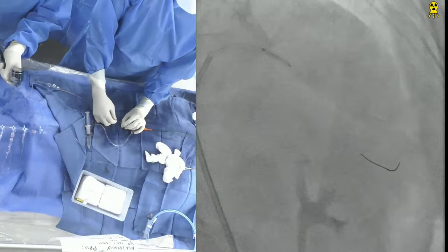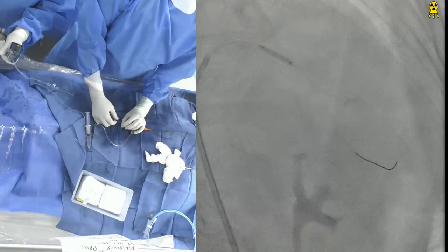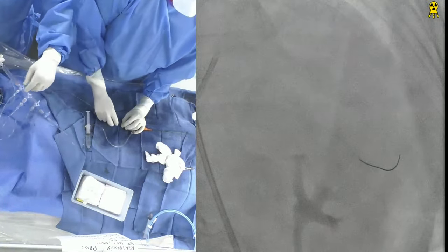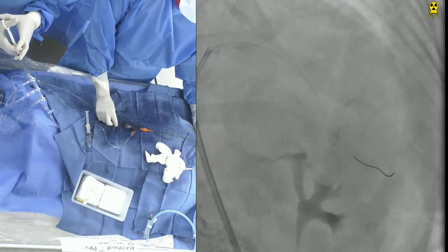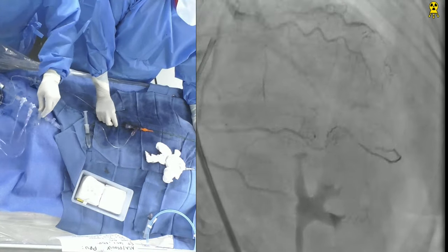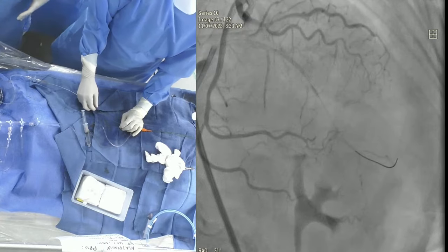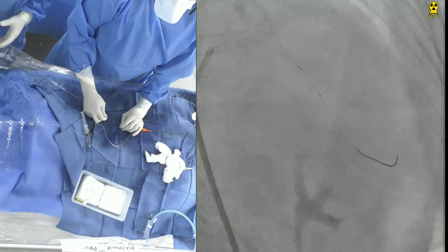Oh yeah, this is the one. And then once you stabilize there, then you go to high pressure, 16. Okay, ready? Yeah. Could be a pseudo lesion distal. Now, could that be a pseudo lesion? Let's dilate a little bit there. But remember, it was very tortuous. Yeah, here. Good. Low pressure.